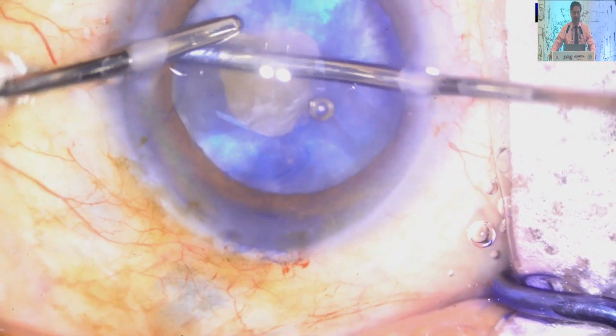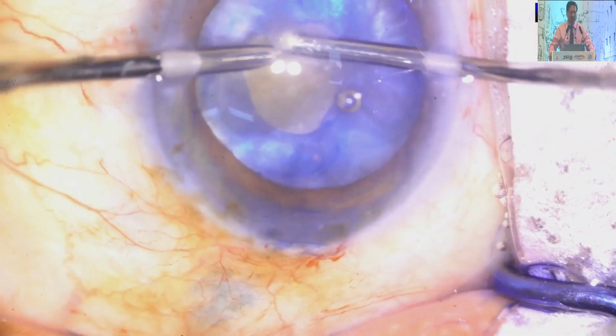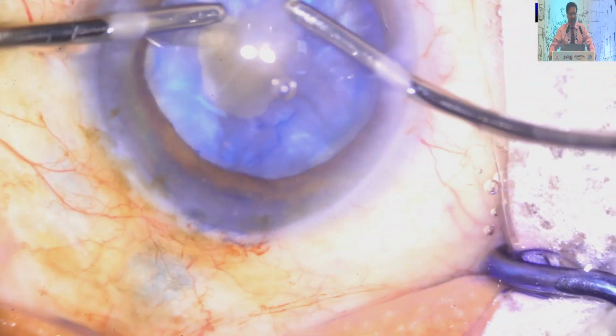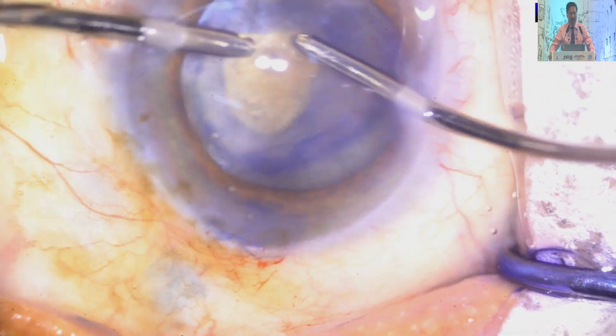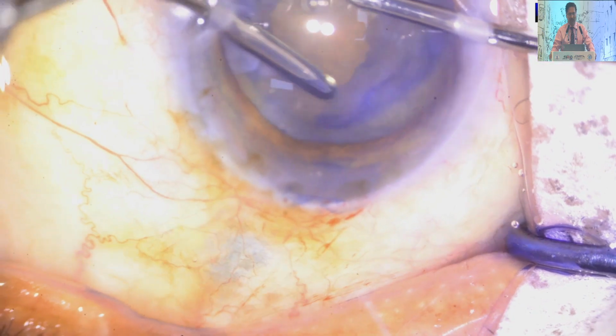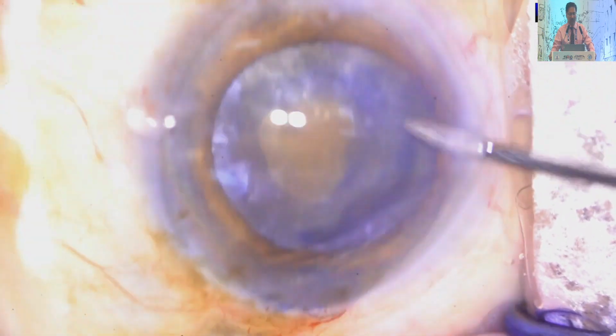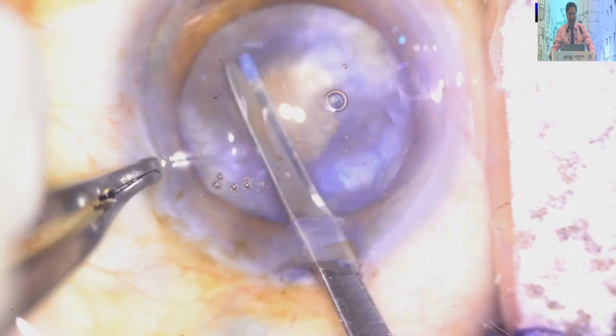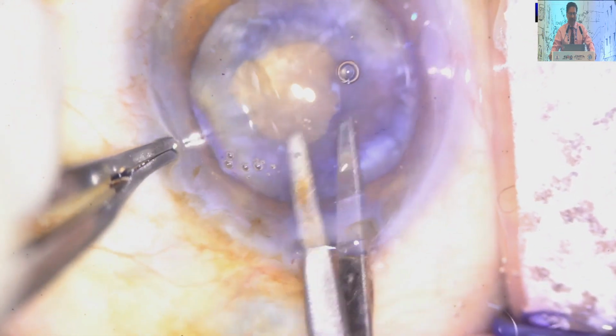So decompression of the capsular bag is the main important point in intumescent cataract. And before going for this type of cataract surgery, you can go for anterior segment OCT also to find out where is the cortical material or the fluid part in the capsular bag. That is also helpful if you have anterior segment OCT.